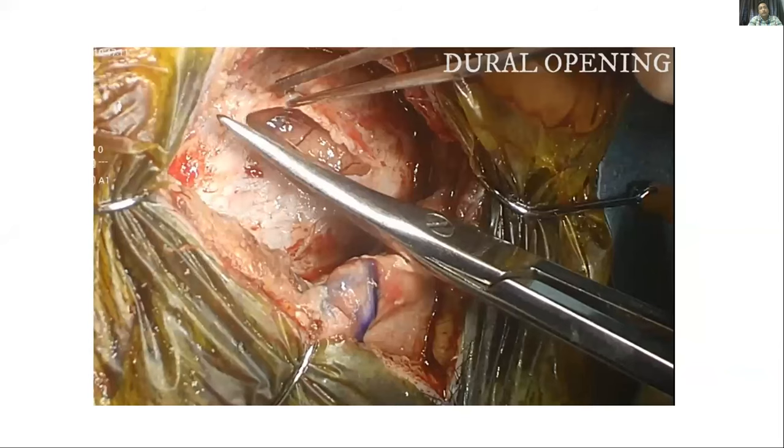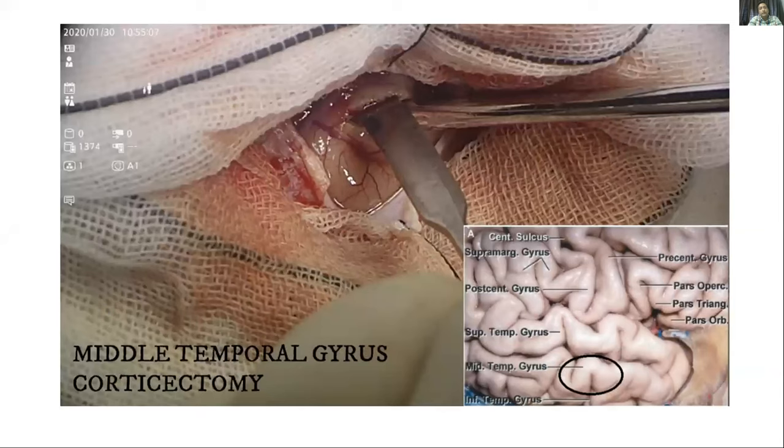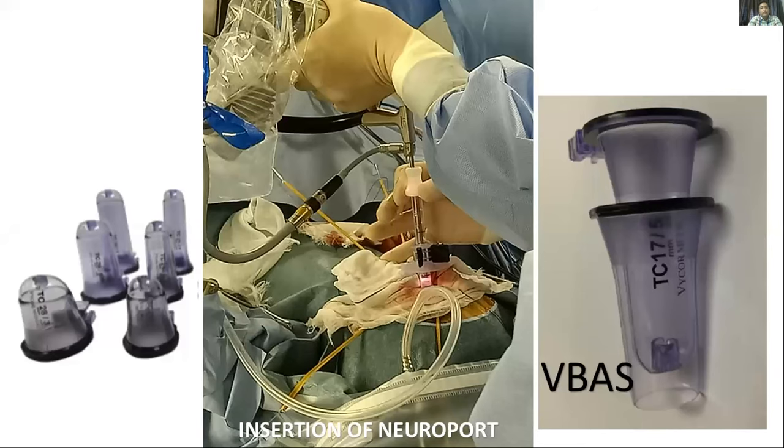The dura was opened over the middle temporal gyrus in a curvilinear fashion, and a small corticotomy of around 1.5 centimeter size was made over the middle temporal gyrus. A ViewSite brain access system was inserted.